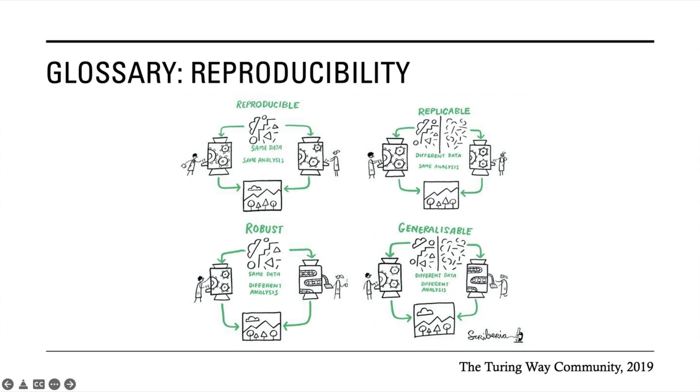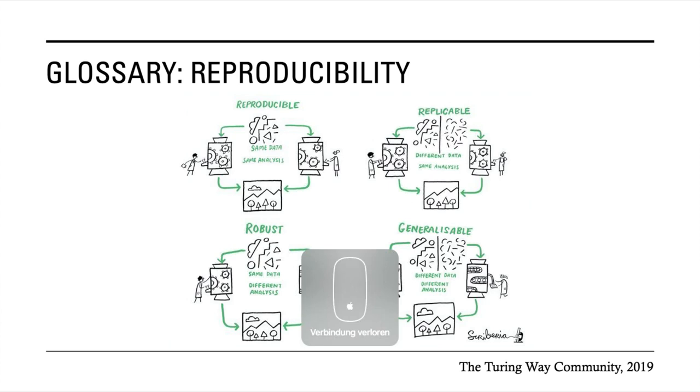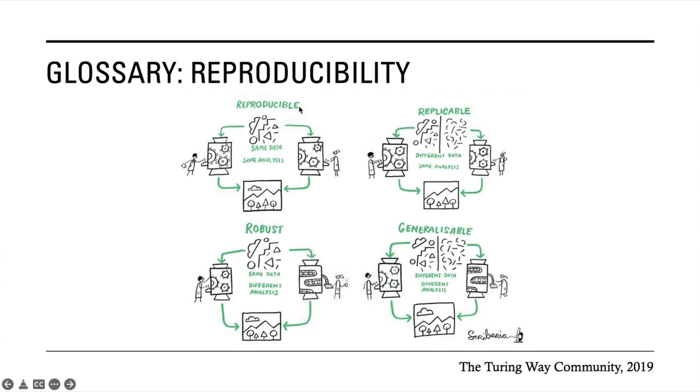So there are different definitions of reproducibility. The first one is computational reproducibility. So detailed information has to be provided about code, software, hardware, and how this all was implemented. Then there's empirical reproducibility. So detailed information about non-computational scientific experiments and observations must be shared and freely available. And then there is statistical reproducibility. So detailed information must be provided about, for example, the choice of statistical tests, the different model parameters and threshold values.